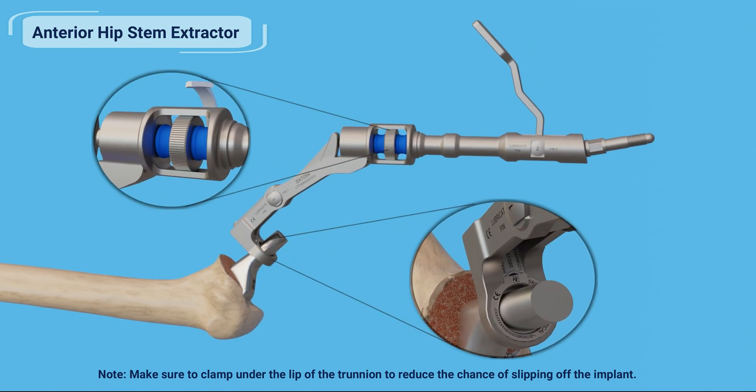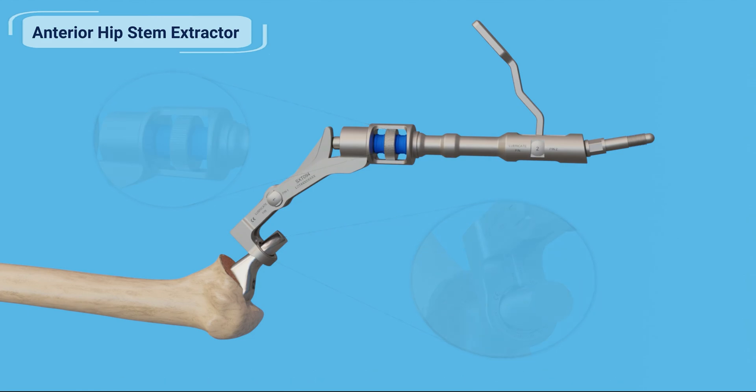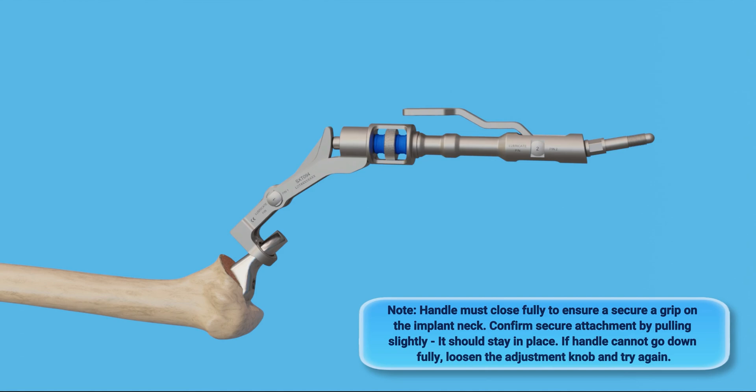Tighten the adjustment knob on the extractor handle by turning it, then continue to adjust until the jaw has firmly gripped the trunnion of the hip stem. Close the cam handle by pushing it down towards the extractor frame — this will lock down the jaw onto the trunnion.